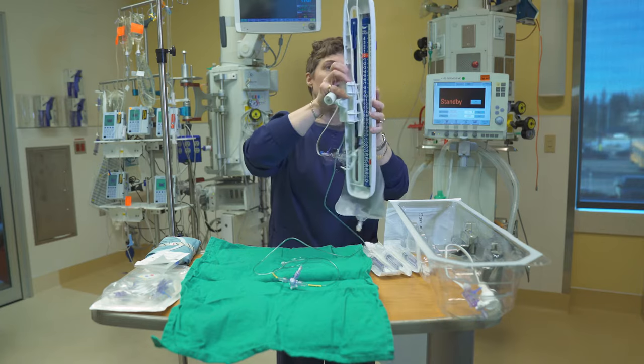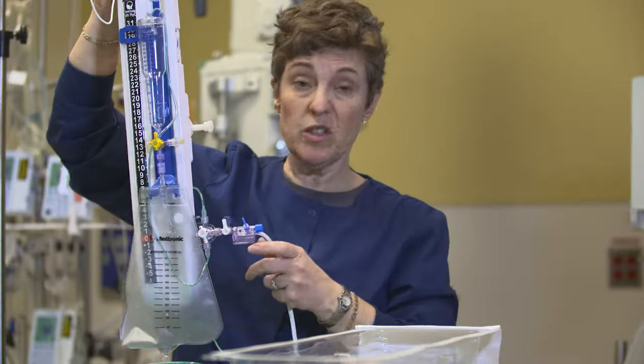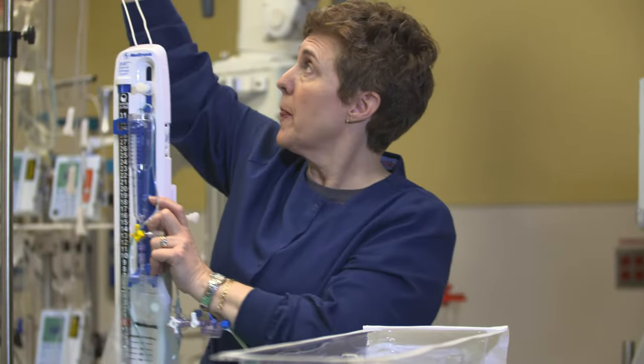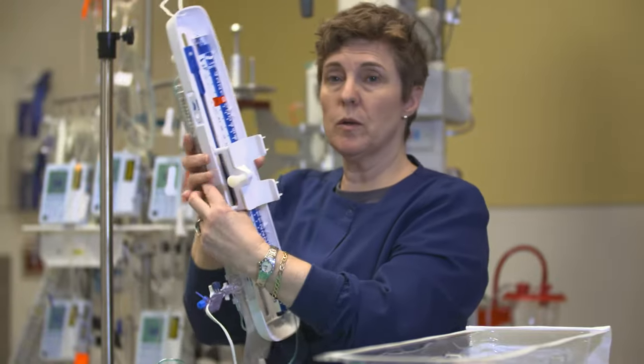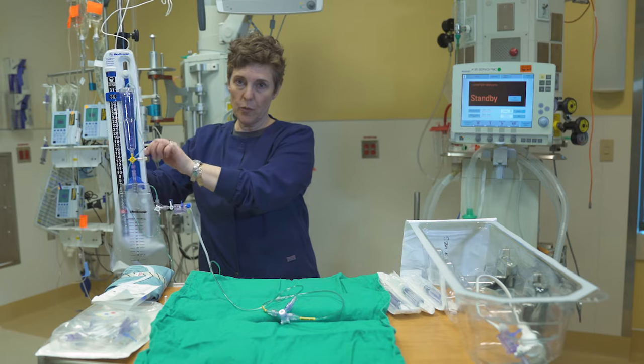When you're getting ready, there's a double redundancy with these systems. I'm going to hang it from the pole with this cord, but I'm also going to clamp it to the pole with the clamp on the back. The last thing we want is for one of these to fall down, so we want to make sure that if something happens to the clamp, it is also on this cord at the top of the pole.